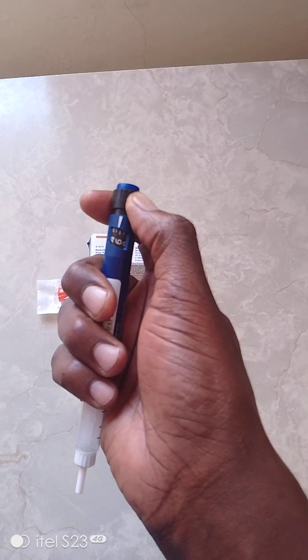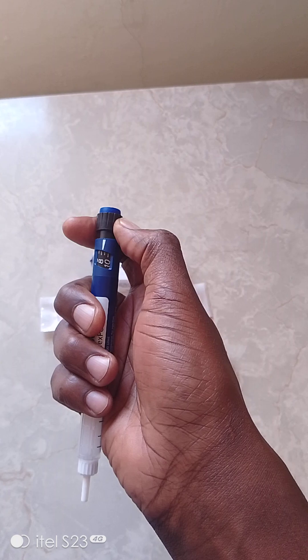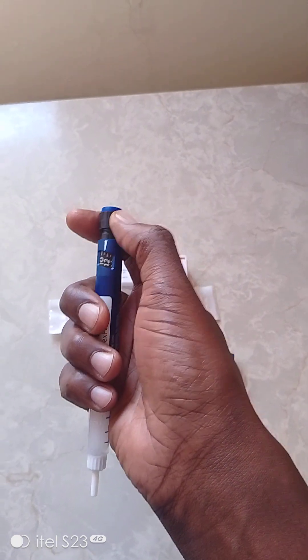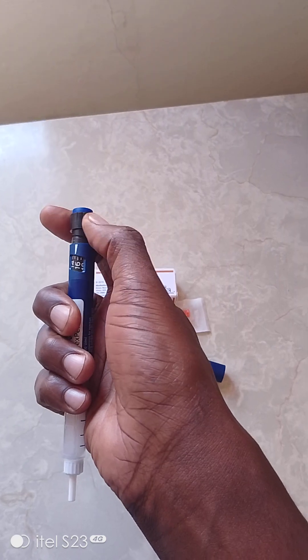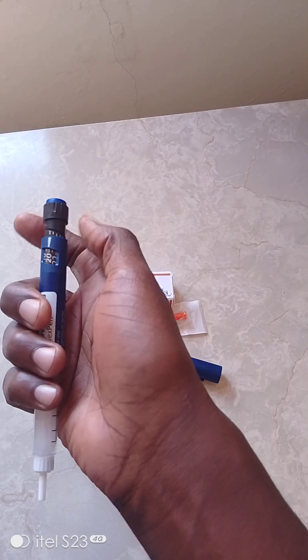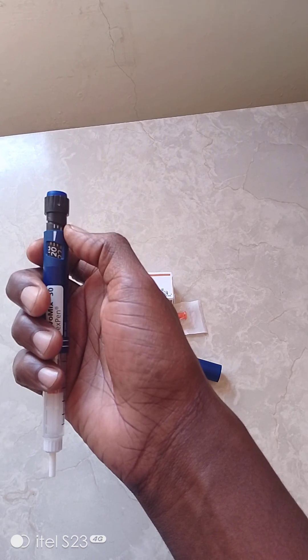For example, if the doctor prescribes that you inject 10 units in the morning, you rotate this dial - that's four, that's six, that's eight, that's ten. Some people in the morning inject a higher dose, so they go on until maybe 20 units. It's measured already in units, so that's how you adjust the dose.